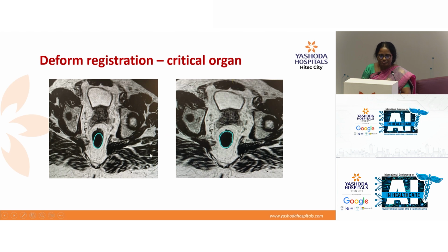So for example, these are all our own images. And this was the initial rectum which we planned during the first day of radiation. But we see that there is a little bit of gas in the rectum. If there is too much gas, we cannot go ahead with the treatment. We'll ask the patient to step down and pass the gas and again go for the treatment. But this amount is acceptable for a radiation oncologist.